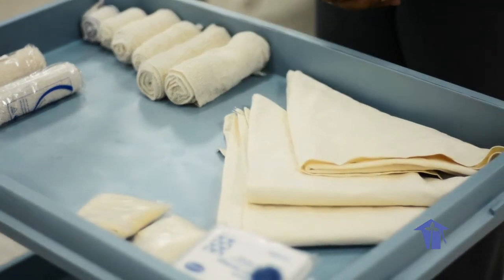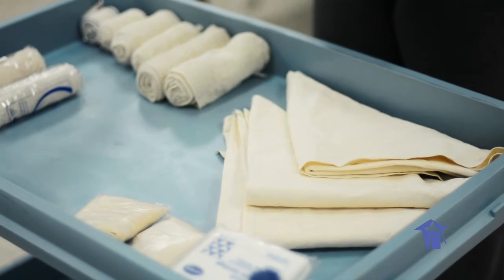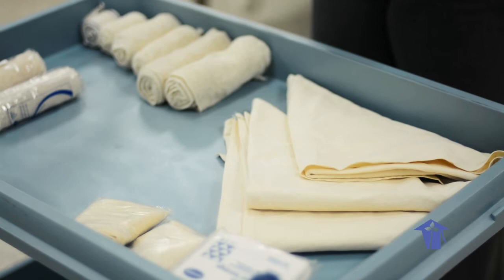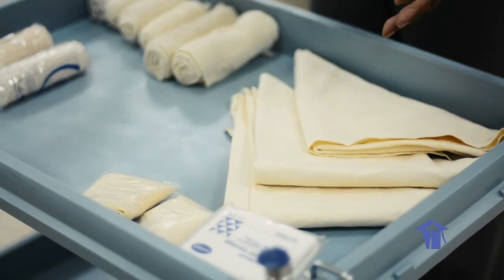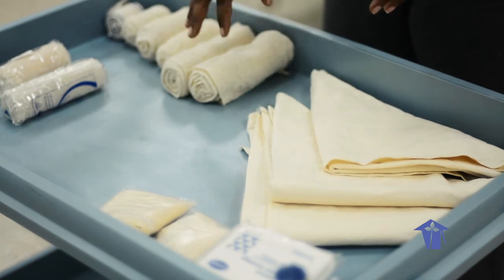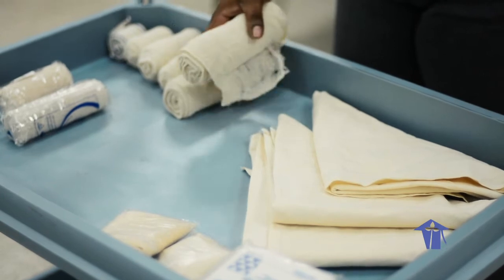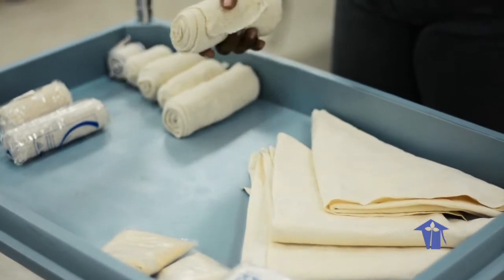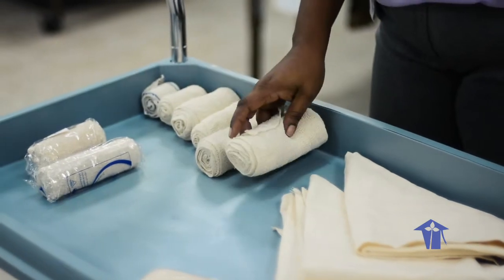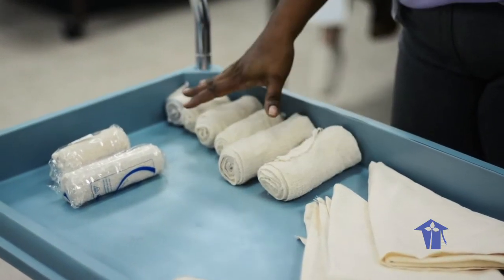Every nurse should know how to apply an appropriate bandage, and this is even important in basic first aid — that anyone can be taught how to apply a bandage correctly. A bandage is simply a length of fabric. In the clinical setting, we tend to use commercially prepared bandages made from an elastic, porous, light, breathable cotton material of appropriate lengths. Most bandages are about three feet long and come in various widths.